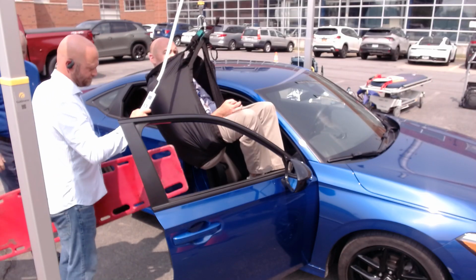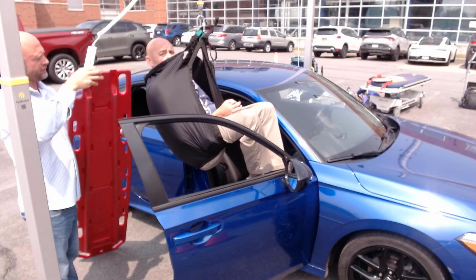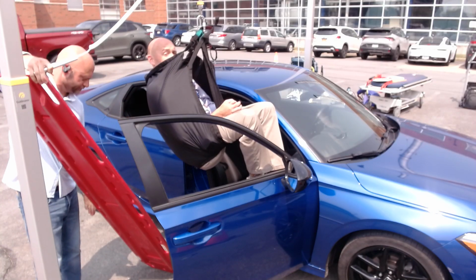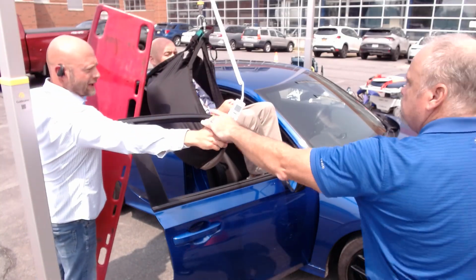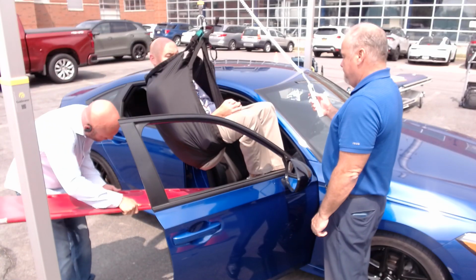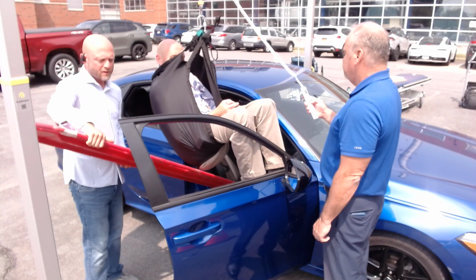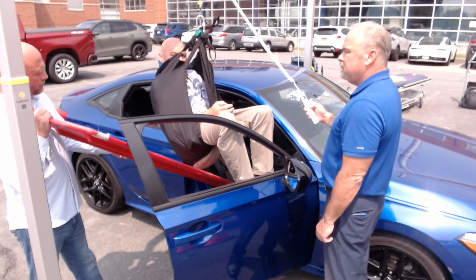So if you do have a ceiling lift system in your vehicle, in your ambulance bay, and you do need to get somebody back in, again, we don't recommend this, but if you have to do it, I'm just going to place the slide board in just on the lip of the seat. Again, the lift is supporting all of his weight. So I'm just guiding the board.